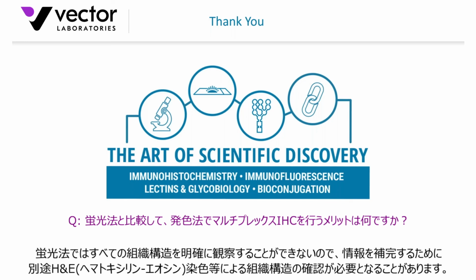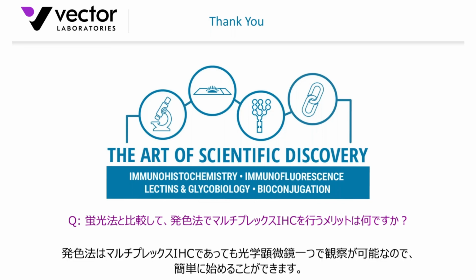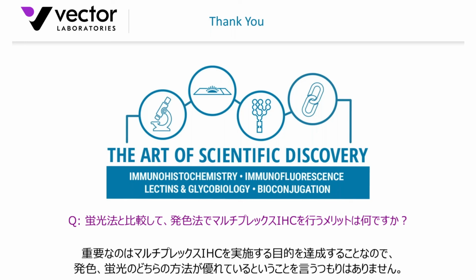But then again, not everyone has access to the filters or fluorescent microscopy in a given lab. Certainly, as I've shown, you can easily get started with the chromogenic methodology. I think it's an extension of single label light microscopy. So there'd also be ease of application, whereas immunofluorescence might take a little longer to work up and optimize too.